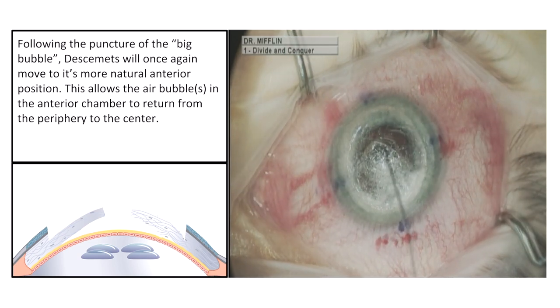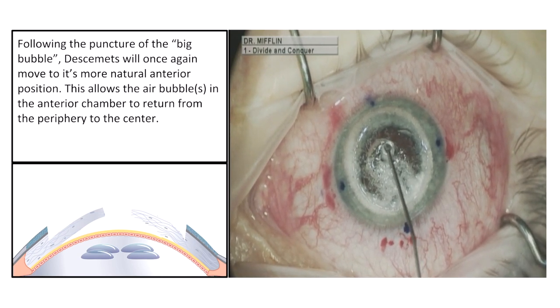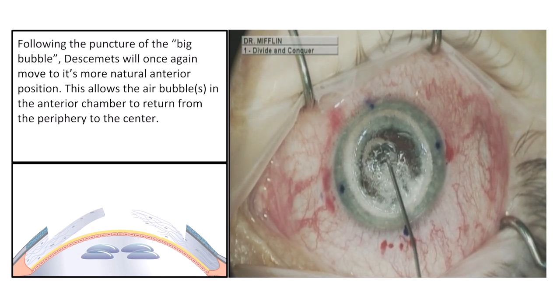Following the puncture of the big bubble, Descemet's will once again move to its more natural anterior position. This allows the air bubbles in the anterior chamber to return from the periphery to the center.